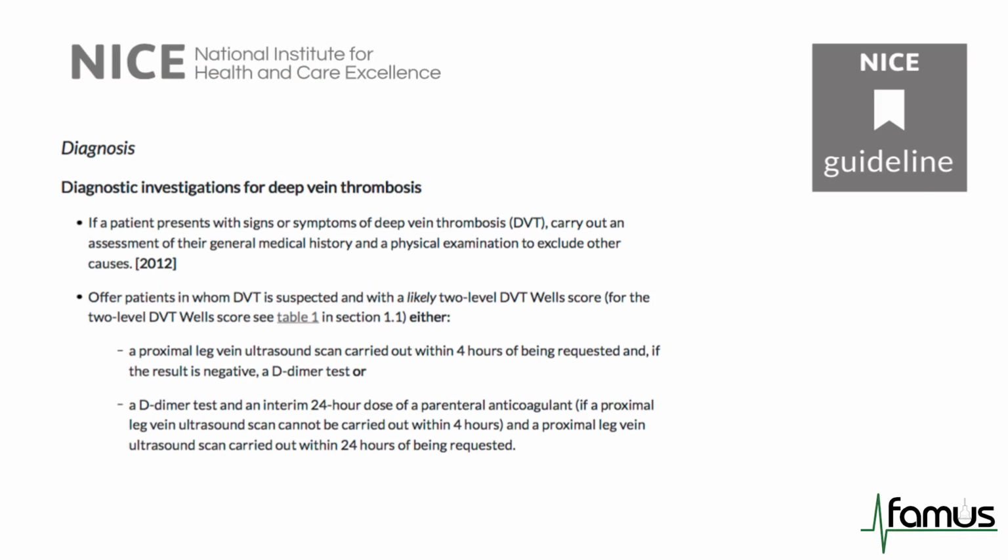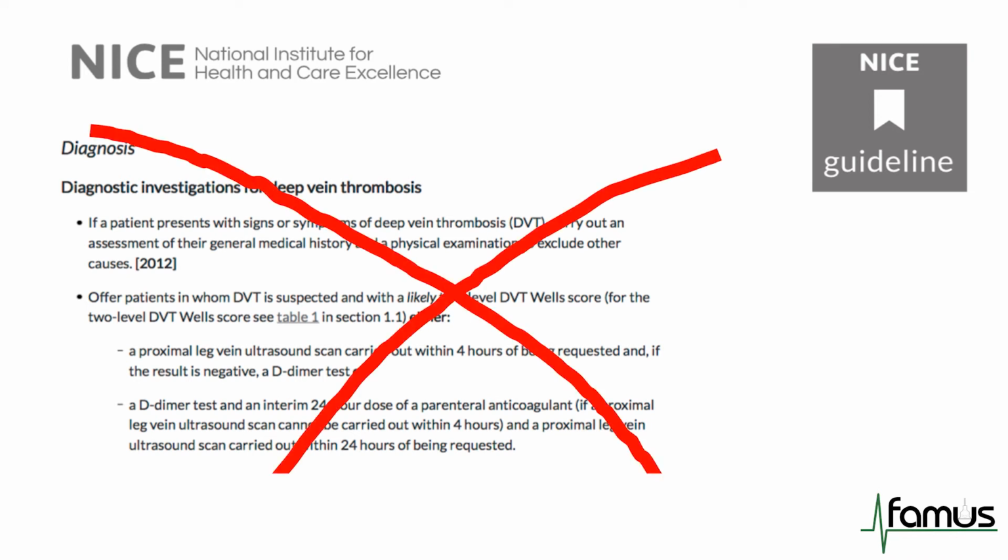Now, it's important to say that the technique I'm going to talk about is not equivalent to a rule-out scan. So this will allow you to confidently rule in DVT, but it is not the same as a departmental scan for the purposes of NICE scanning.